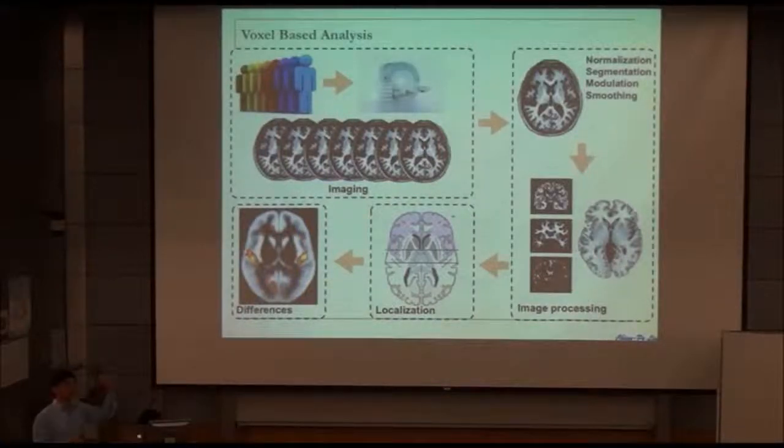That means we have the patients in a group, and normal subjects in a group. Then we bring both into a standard template. Then we have the statistical analysis. So that's the basic idea for such studies, to know the difference between two groups, or the difference in dementia patients.